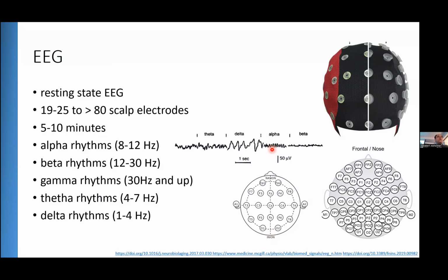But when we start even with a mild somatosensory or motor task, or a not very difficult cognitive load, this activity will change to the beta spectrum. So the frequency at which our brain is working is going to be higher, and the amplitudes are going to be lower. The beta spectrum is between 12 and 30 hertz, as you can see here, and the more cognitively demanding or more difficult the task, the higher the frequency will be.